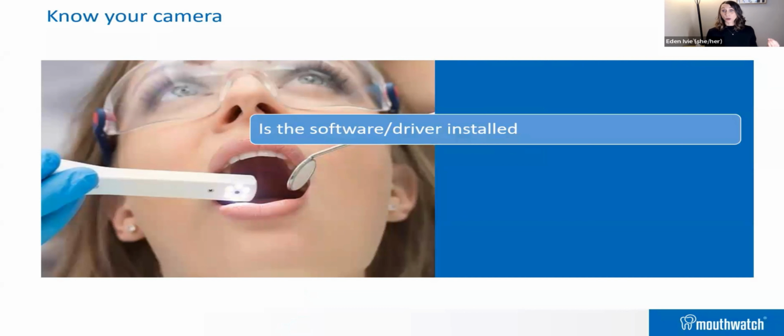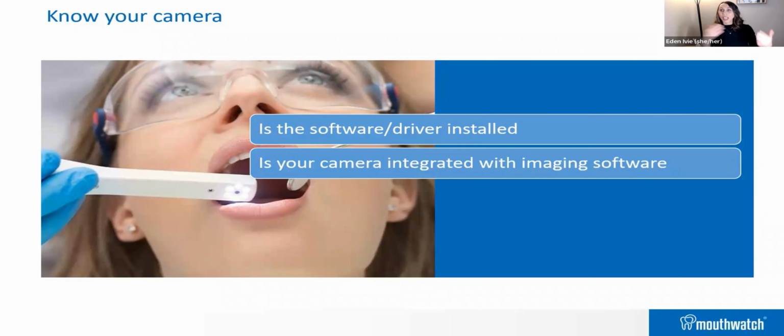All right, so knowing your camera, you need to make sure that your software is installed. Most cameras will have a software or a driver, a small piece of software that needs to be installed so that the camera can connect to your imaging software. If you're new in an office and you don't have the original paperwork for your camera, you can find user guides online. If you have a Mouthwatch camera and you need to install button capture software or look at any instructions, you can go to mouthwatch.com to our support page.